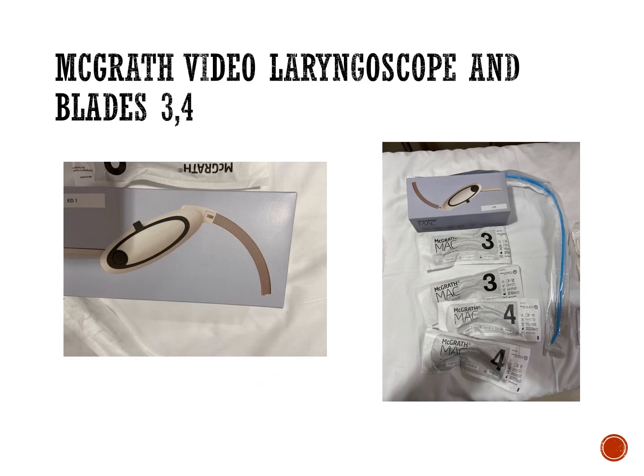For the video laryngoscope, I use the example of the McGrath. McGraths are great, but there are many other equally good models out there as well. You see the scope itself on the left-hand side, and then you see the 3s and the 4s along with the box that it comes in. We put a bougie in this image as well, so you can see in order of size and magnitude how things would play out.